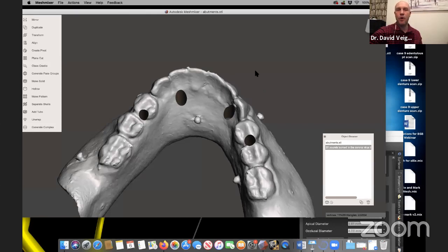Okay, how do you do the bone segmentation yourself or delegate to BlueSky Bio? How much time does it take you to do this?